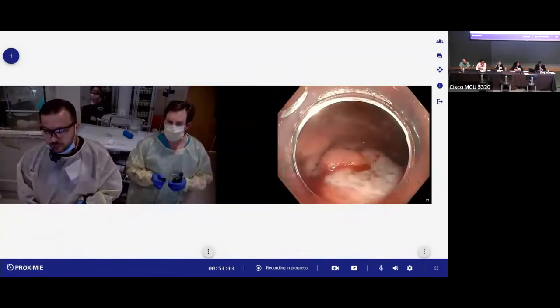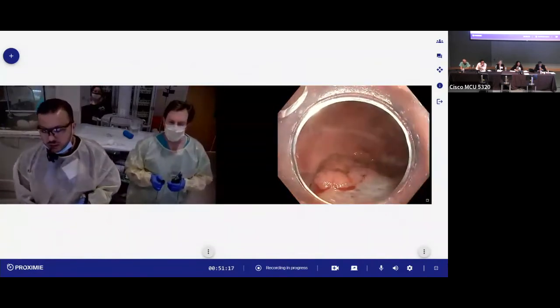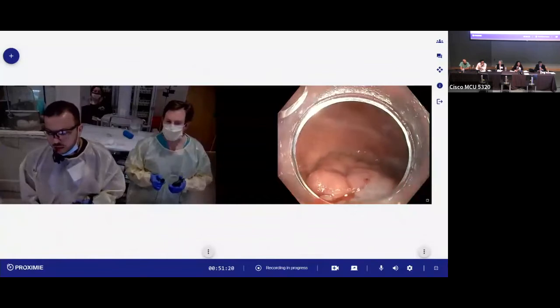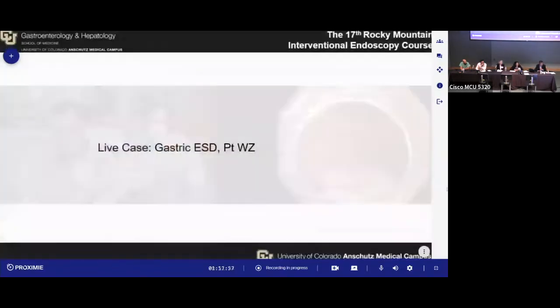Hazem, before you cut, we want to show what's happening in Dr. Athman's room. So can you just hold off on that first resection, please? Let's go to Dr. Athman's room, please. Thank you. Thank you.